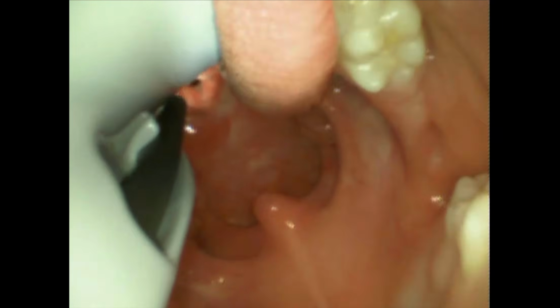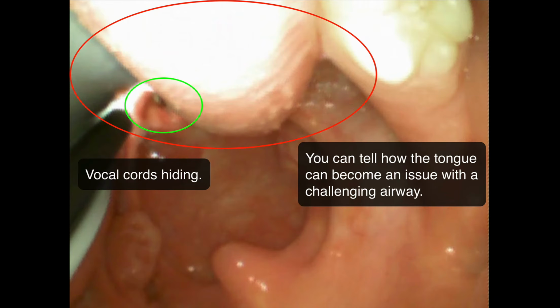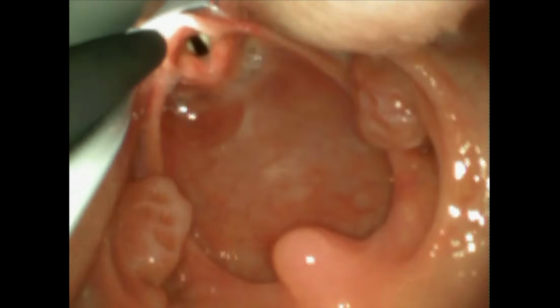As we proceed down, you can see right here how that tongue really obstructs your view. Behind the tongue, there's a great view. In this case, it's okay because they had a grade 1 airway to begin with, so it's not an issue. But again, just better technique is to make sure that tongue is completely out of the way. Here you see the vocal cords hiding behind there.